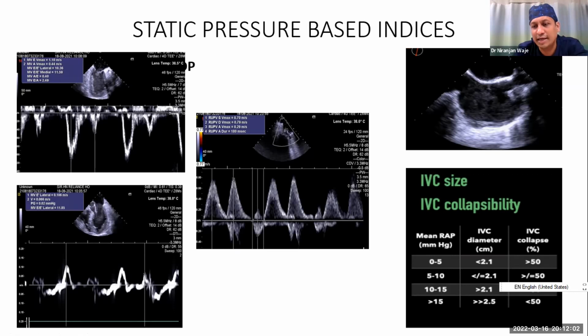We have many devices like FloTrac and others, using SVV and PPV, indicating fluid responsiveness. They are non-invasive and they're good. They say if the number is more than 15 or 20, they give fluids. Less than 15 or less than 13, as the number goes down, you should not administer fluids.